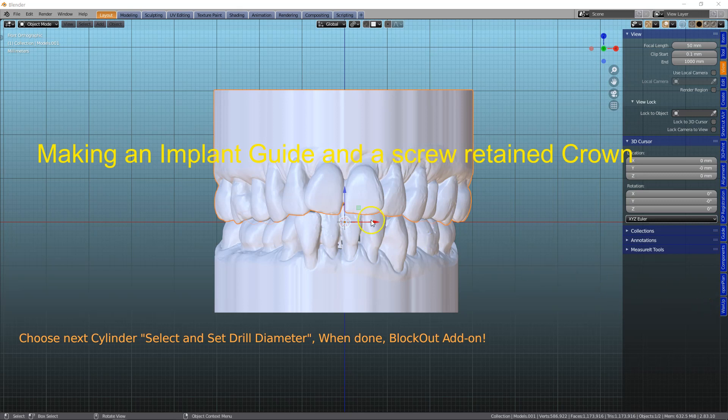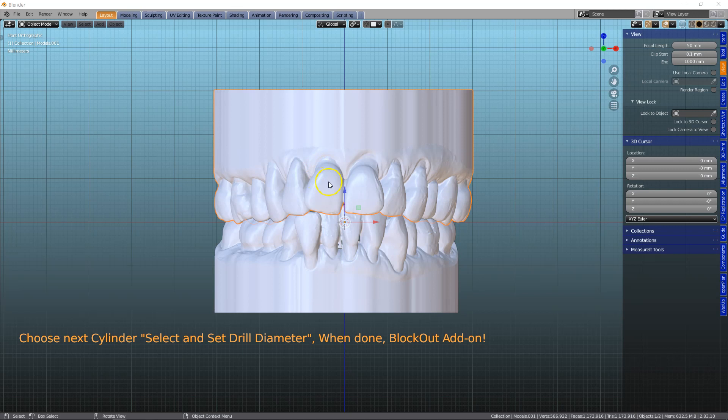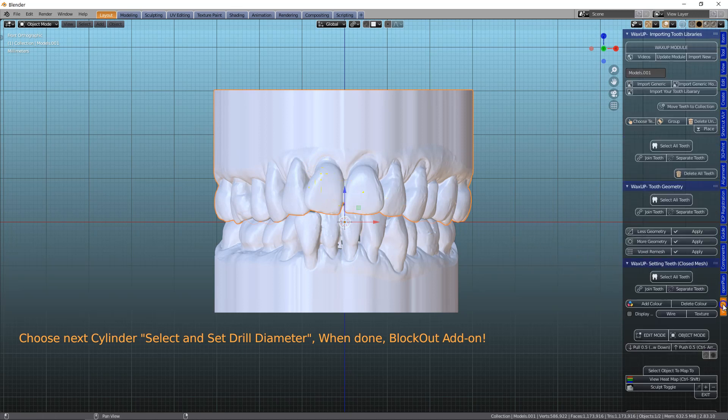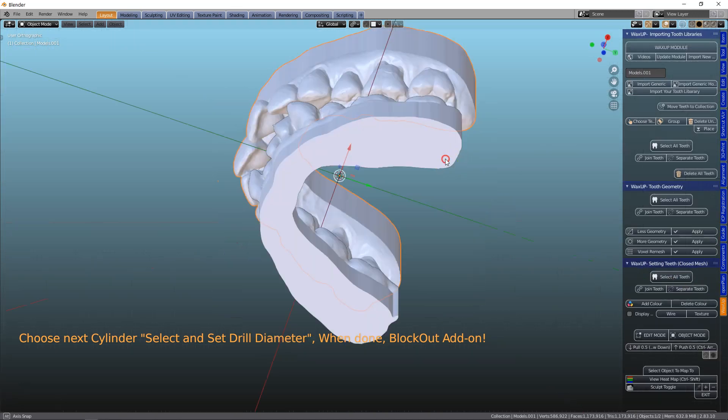In this video I'm going to be sectioning off the tooth 1-1 and joining it to an implant. So let's go for it.